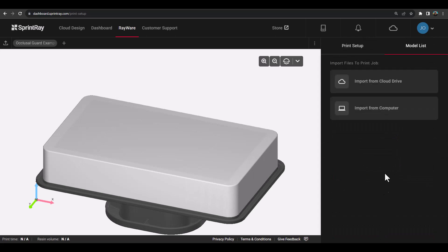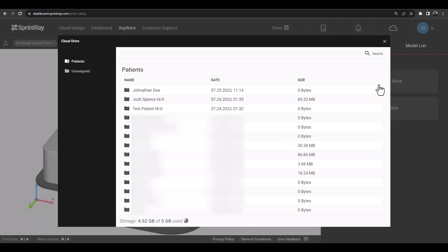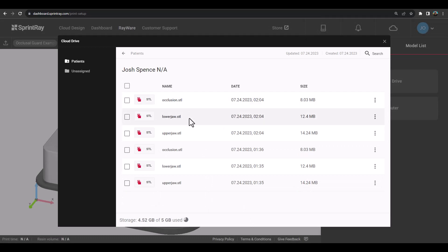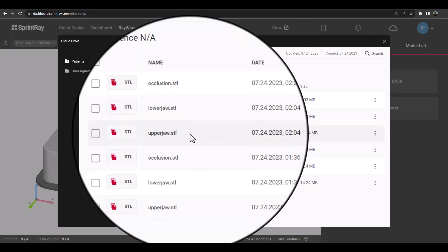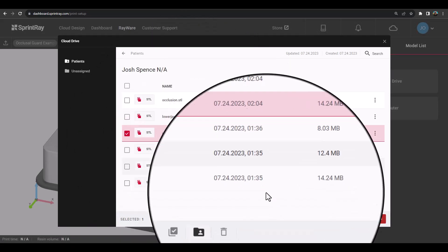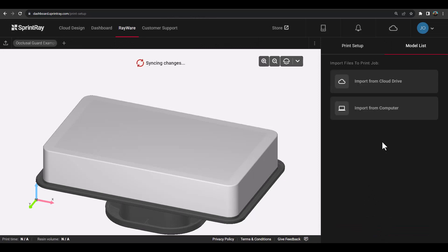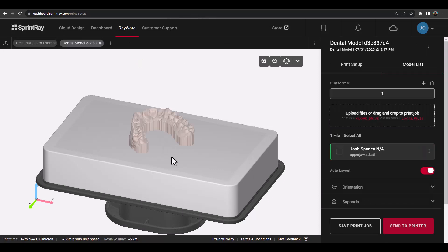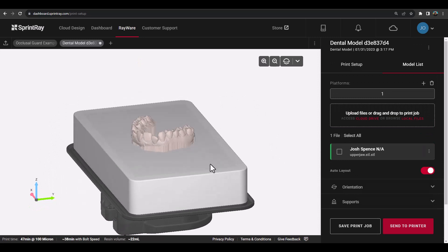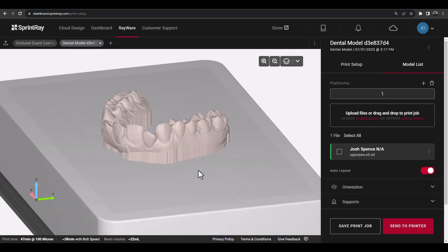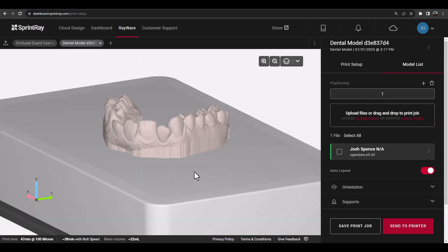Then select whether you're going to import models from your cloud drive, as shown here, or upload them directly from your computer storage. In this example, we have uploaded a raw intraoral scan using the default model profile and Rayware Cloud has automatically added a base to the model and made it printable.